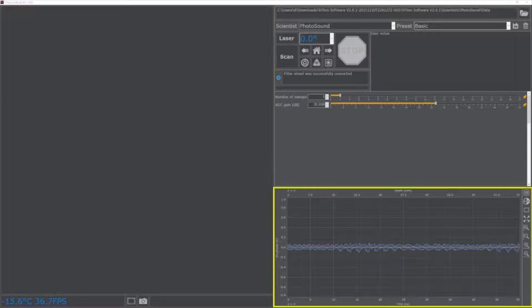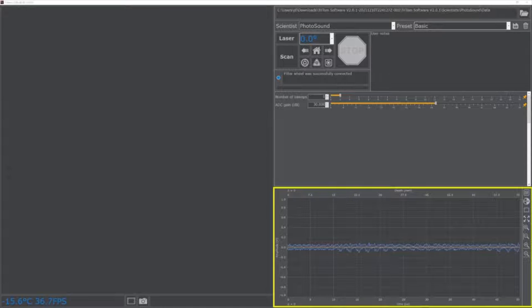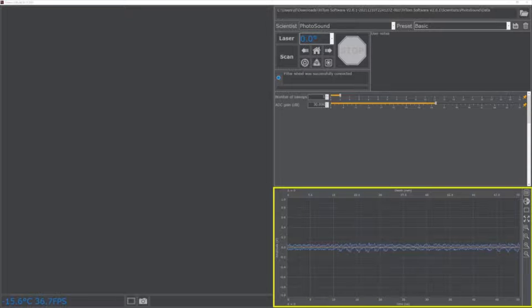The photoacoustic signal viewer displays photoacoustic signals in real time. The yellow plotline shows an individual channel of interest selected by the user. The green plotline shows the maximum and minimum values of the user selected ADC.